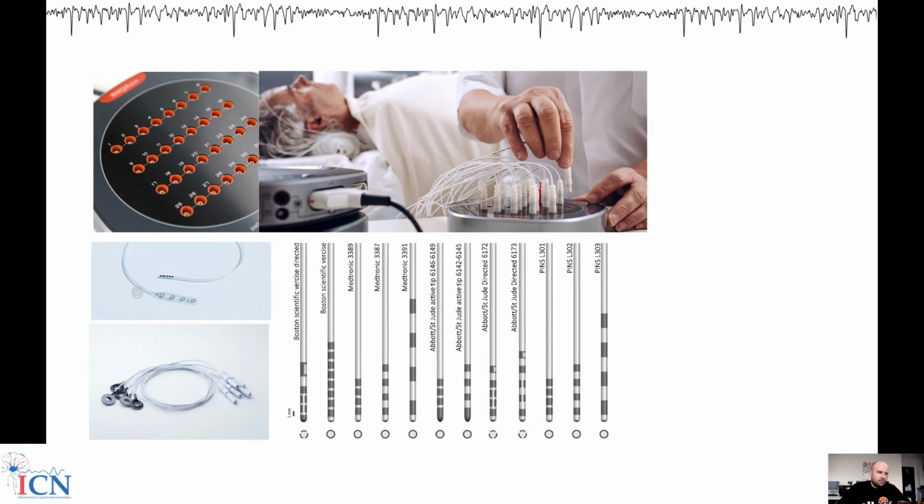It's not even the case that, I mean, many patients in our clinic are stimulated via one of the directional contacts as the best clinical contact, but we could not see that this particular contact would show a very specific pattern for why it was chosen. There are many reasons why we probably couldn't find it, but I would also argue that it's not so straightforward, and maybe the recording is not as localized as one usually thinks.